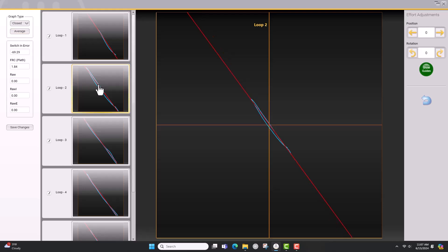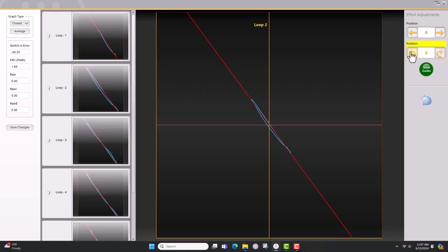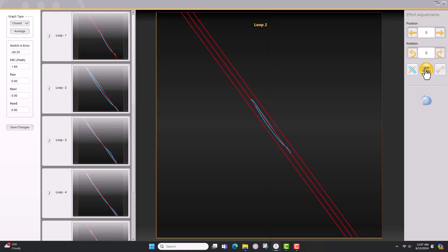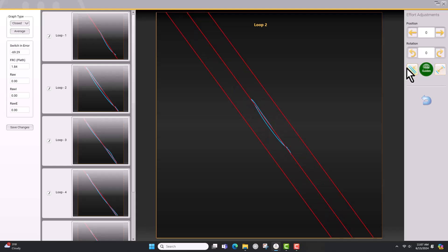On the left side of the screen, click on the graph you want to adjust, then use the rotation arrows to adjust the line of best fit. You can also display guides to help you with the angle adjustment. On the upper right, click on the Show Guides button — three red guides will be displayed and will rotate when you click on the Rotation button. The guides can be opened or closed using the button to the left or right of the Hide Guides button.